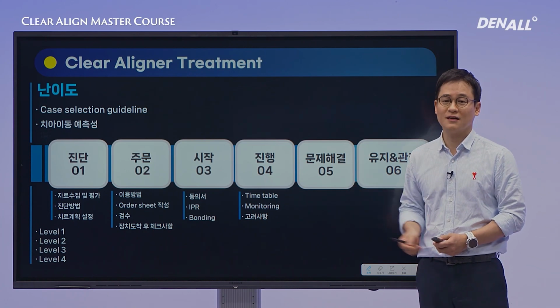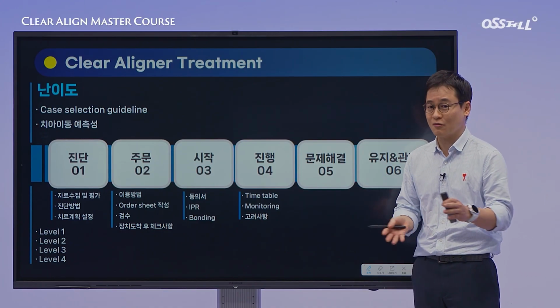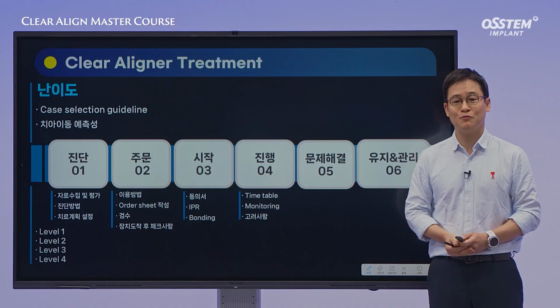I explain the same process each time: how to make an accurate diagnosis, how to set up an order, how to get started, and how to manage the progress. Today, we will take a closer look at how these treatment steps are applied in an actual case.